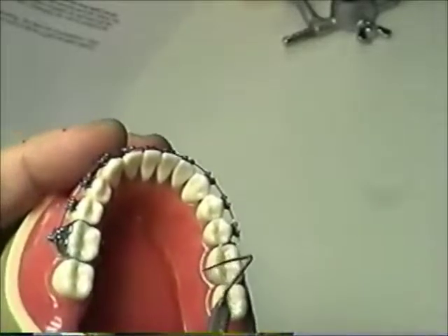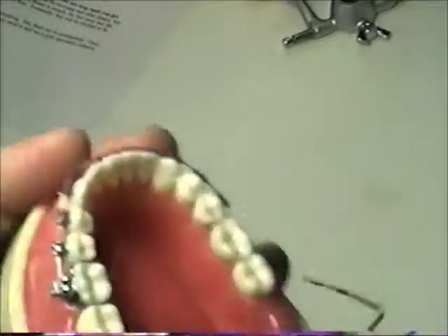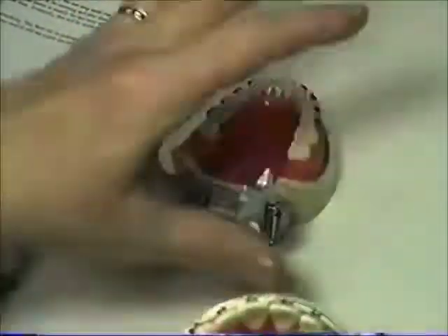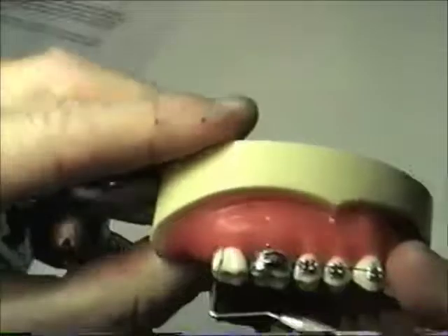Now, if you water pick here, then come up here, you missed all these. How do you know what you've missed and not missed? So then you come all the way around, then you do all the fronts, and then on your upper teeth, you've got the same thing.